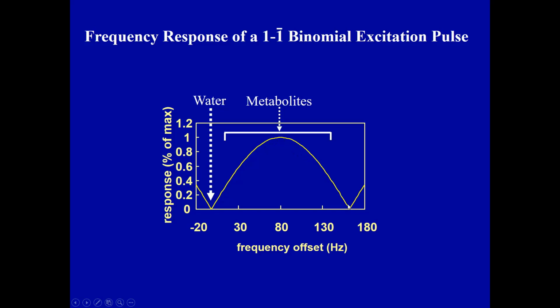It was very useful at the time, and to overcome this, there are other arrangements of pulses that Hobie Hetherington and other people have created to get much flatter profiles.